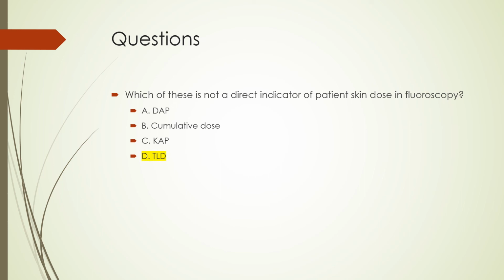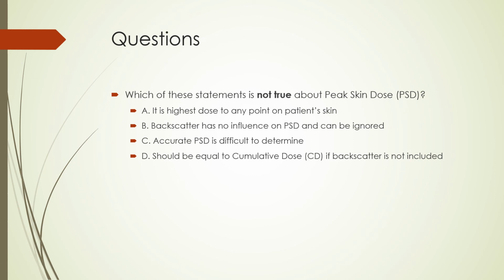TLD. Next question: which of these statements is not true about peak skin dose? Your choices are A. It is highest dose to any point on patient skin. B. Backscatter has no influence on PSD and can be ignored. C. Accurate PSD is difficult to determine. D. Should be equal to cumulative dose if backscatter is not included. The statement which is not true is B. Backscatter has no influence on PSD and can be ignored.